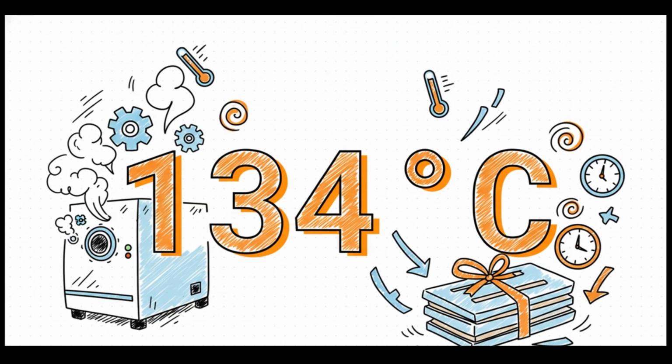But in a busy OT, sometimes you need a faster turnaround. That's where the flash cycle comes in, which is really common in those pre-vacuum autoclaves. For that, the standard is 134 degrees Celsius at double the pressure, 30 psi, for just 3 to 4 minutes. This speed is what helps keep the whole surgical schedule moving.